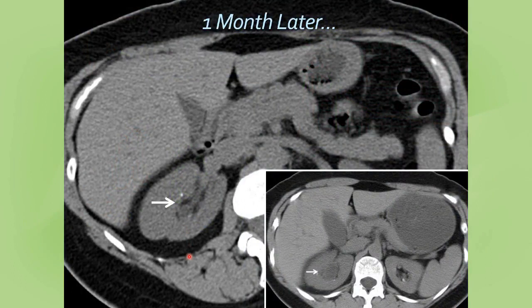So this is our patient. We've gone through her diuretic renal study. Everything looked normal. And sure enough, it makes sense that a month later when she came back for follow-up, that obstructive change has gone away. It's compressed down. You're starting to see the renal sinus fat again. And it's no longer that.